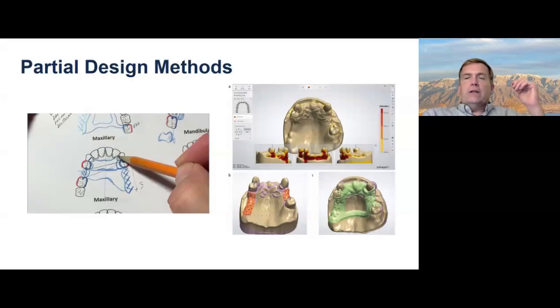The main challenge right now is digital printing technology. As you guys know, right now, subtractive technology, milling, tends to be a little more precise, but it's slow and it's hard on the equipment. So 3D printing is where laboratory technology is headed. And so the only real limitation right now is, can I print the material that I want to make with a 3D printer? And we'll talk about that as we're going along for different kinds of partials.